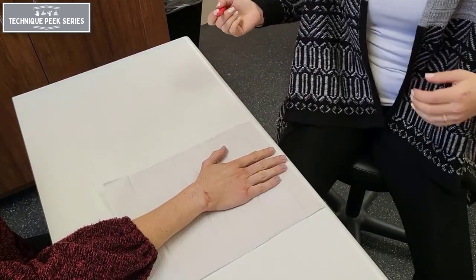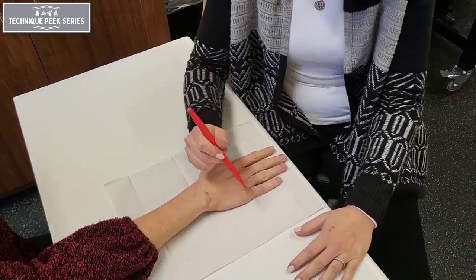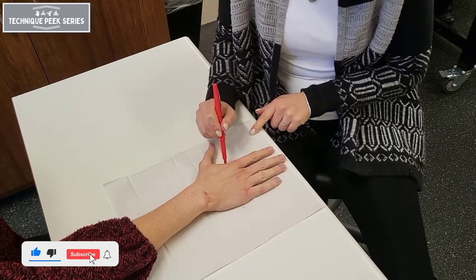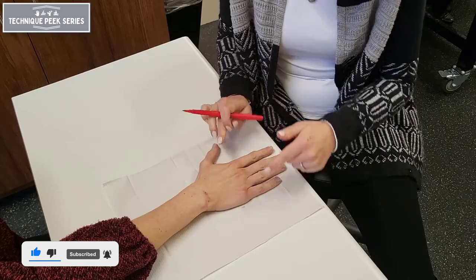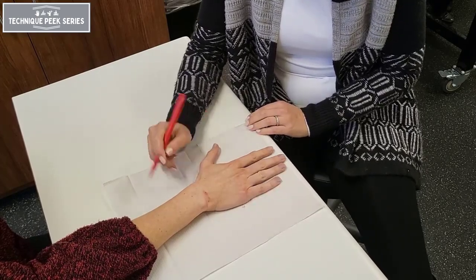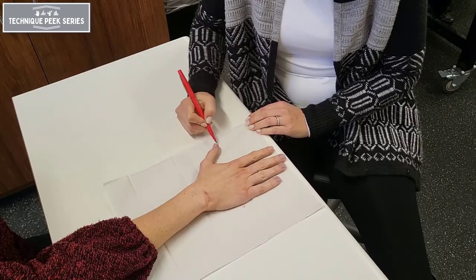This video demonstrates how to make a wrist cock-up splint. First we begin with the pattern, marking the distal palmar crease on the ulnar and radial side of the hand. Next we'll mark the CMC joint and the tip of the thumb.